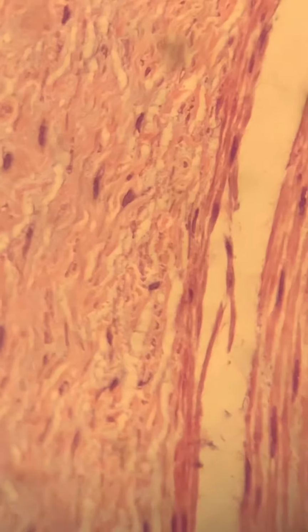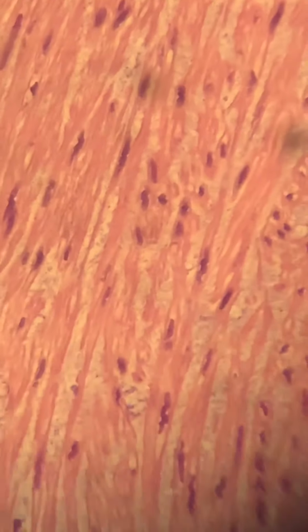As I attempt to change this lens without changing my view of it, let me go over here to this area, and you'll be convinced that there are definitely polys in this blood vessel.